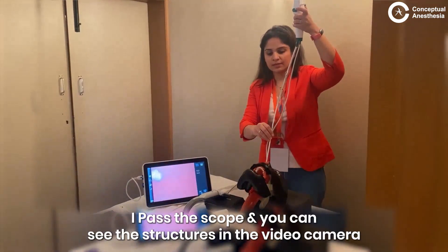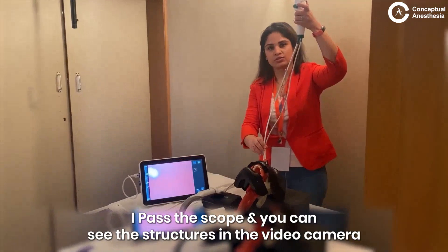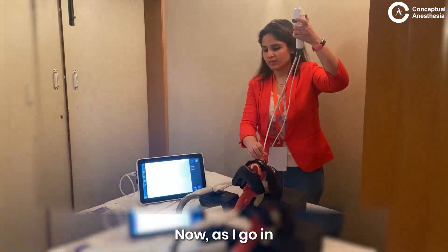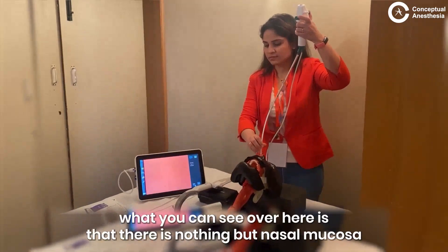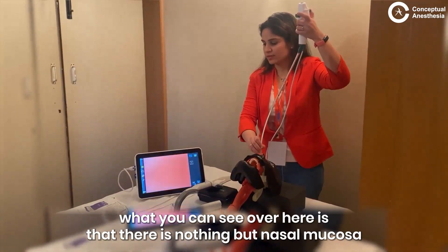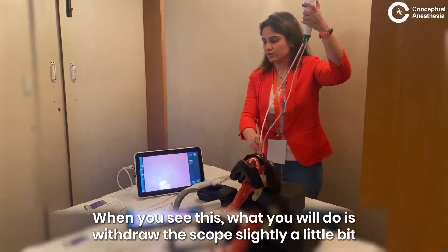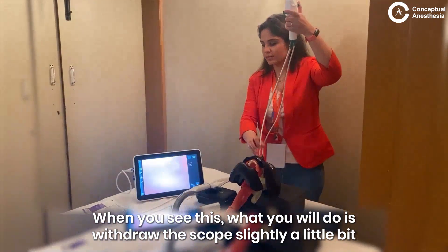I pass the scope and you can see the structures in the video camera. As I go in, what you can see over here is nothing but nasal mucosa. When you see this, what you do is withdraw the scope slightly a little bit.